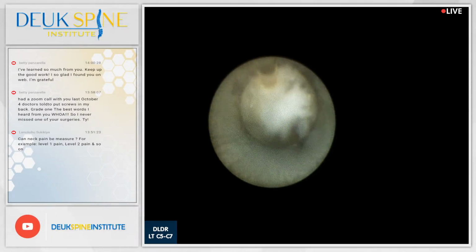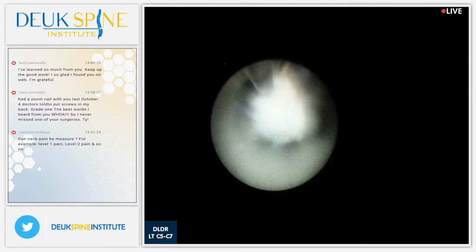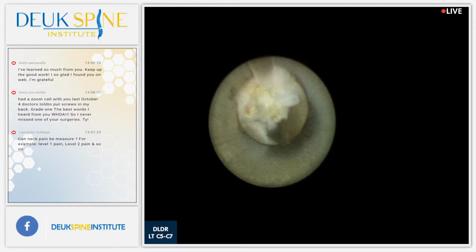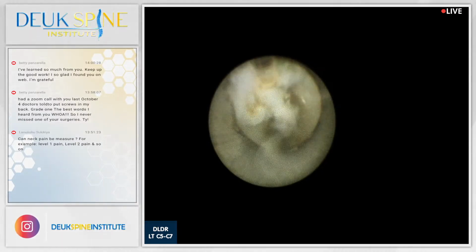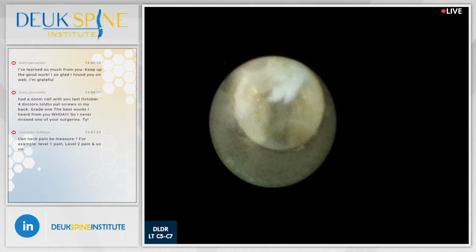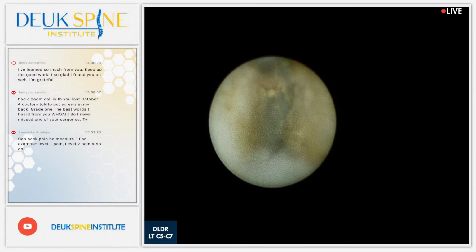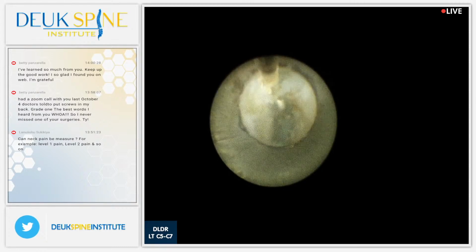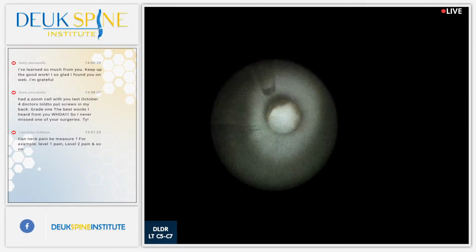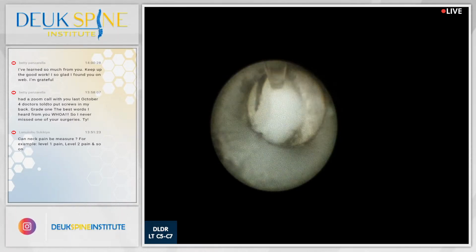All right, questions? Next question from Steve on YouTube, asking, it looks like the guide wire is entering the nucleus and then being slowly retracted and cleaning up along the way. Is that correct? No, there's no guide wire right now. This is a tube. The guide wire is gone. The guide wire was used just for a few seconds. The first thing I did was place the needle, and then I placed the guide wire down the needle. That was on the first disc. And then once we did the first disc, we moved the tube, the dilator, to the second disc. And now we're repairing the second disc. So there's a sequence: needles, guide wire, dilator, tube. And then going to the second disc, you see that piece of herniation right there?